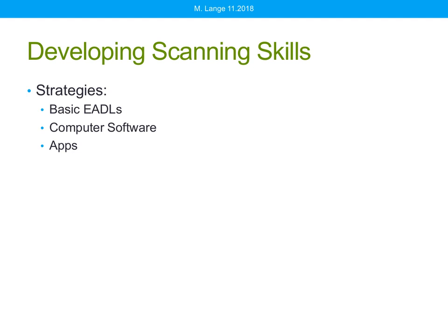So let's talk about some strategies for developing these scanning skills in the clients that we are working with. We can use basic EADLs, electronic aids to daily living. These have been around for a long time, but still can be quite engaging for some of our clients, and I use these frequently to develop scanning skills. We can also take advantage of some computer software programs and some cool apps that are available to us on mobile devices.